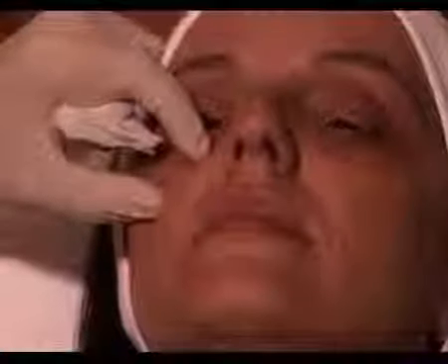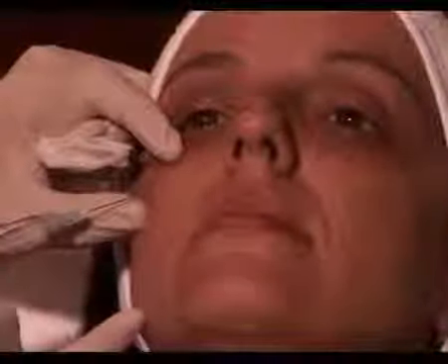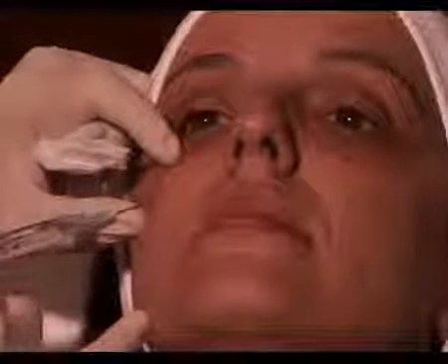If you're going to be using a cannula, it becomes much easier because the cannula is blunt and won't cause any problems. However, if you're using a needle, you can inject in a bolus technique, which is very simple. You touch her zygoma. You can feel the zygomatic arch over here, and a little notch on the lateral side where the two ends meet. I'm going to come in and inject, and I've just touched bone. So you have to inject very deep, and then introduce your bolus very slowly into that area.